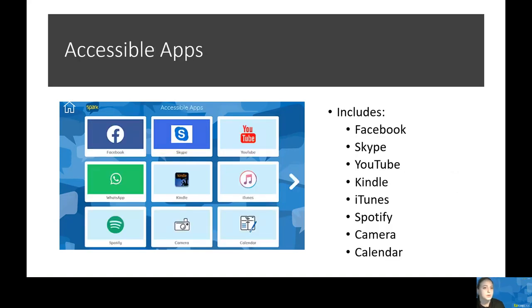There are several different accessible apps for connecting with others, and they're all available through the Spark Portal. This includes Facebook, Skype, YouTube, Kindle, iTunes, Spotify, Camera, and Calendar. These page sets provide large targets that are conducive to alternate access, to navigate through favorite applications with ease.